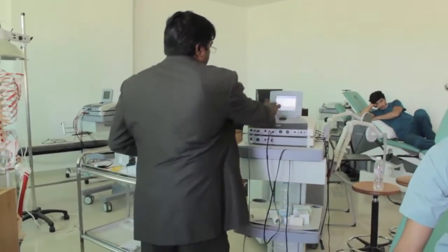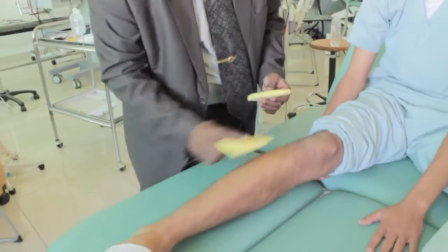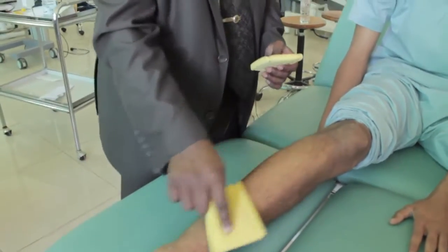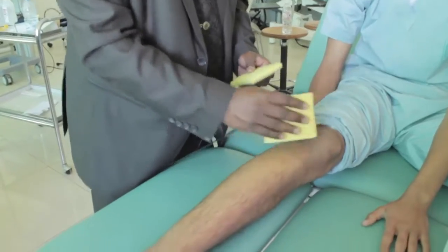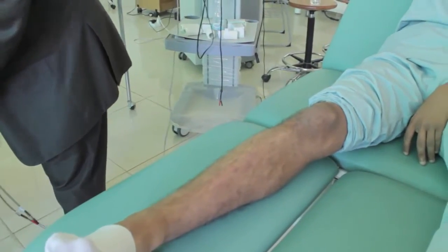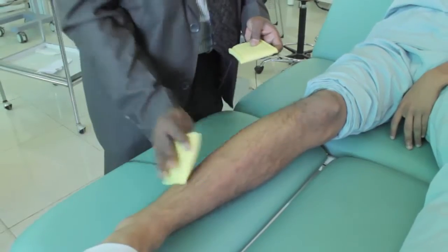So, if this is the muscle I want to stimulate, dorsiflexors, decrease the skin resistance by applying water. Dorsiflexors. Is this gel or water? This is water, no problem. Gel, no problem.